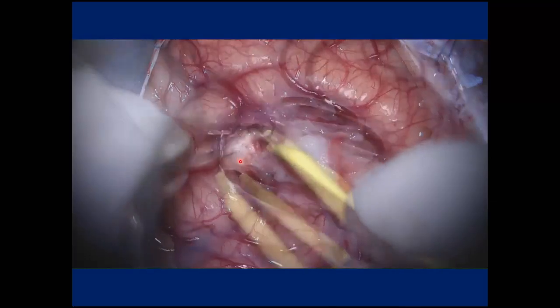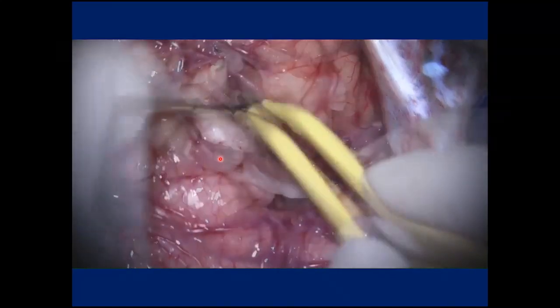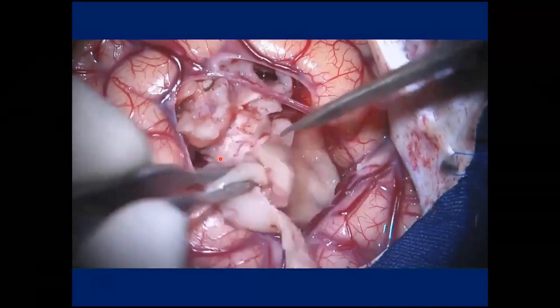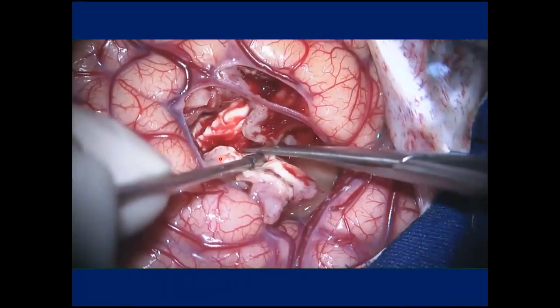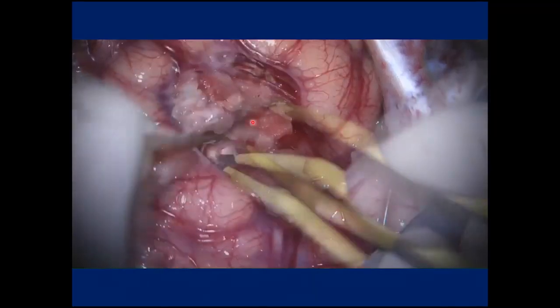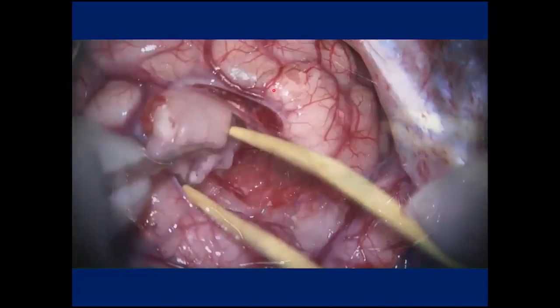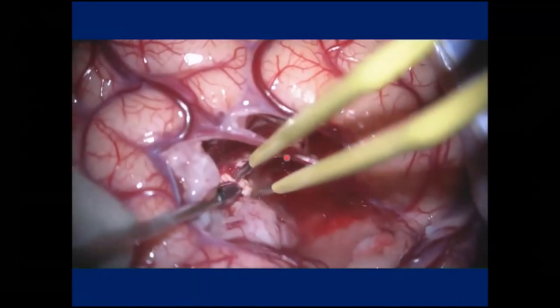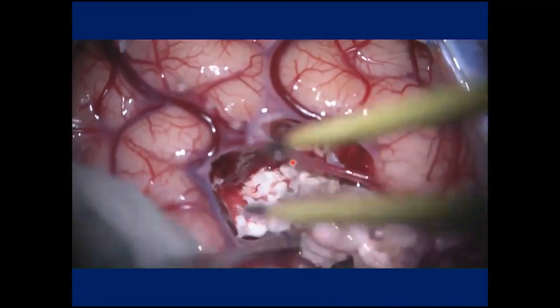And here we are at the upper limits of the resection. We have reached the white matter. And how deep can I go? And not to get into the frontal horn. We have analyzed on the preoperative MRI that the best landmark to resect the white matter and also avoid the frontal horn is to see the location of the superior limiting sulcus of the insula. So I can see the insula over here. And we are already in the middle of the white matter. So I have to check where the superior limiting sulcus of the insula is located. That's where I have to stop, avoiding going deeper into the white matter.